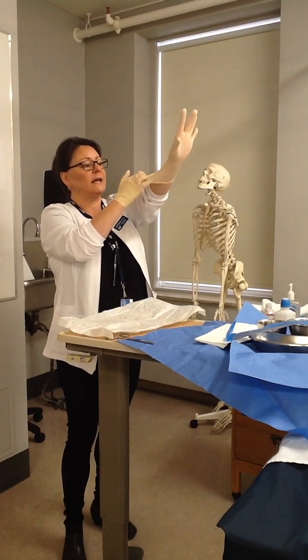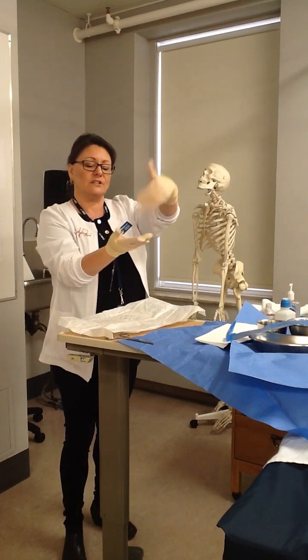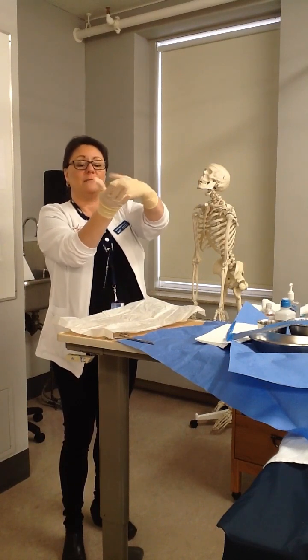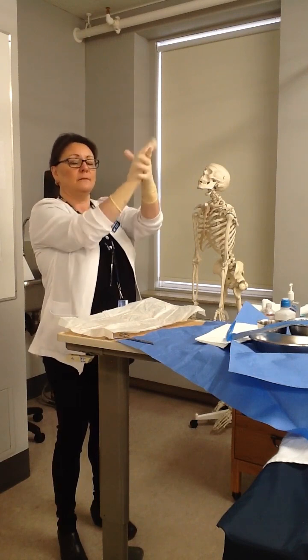And then just gently let go. Don't touch that anymore. And now I'm going to fix this glove, so this sterile hand can reach under this sterile glove. And again, point it up to the ceiling. I'm abducting my left thumb now to make sure it doesn't run down my arm, and I'm just pulling down and making that wave.